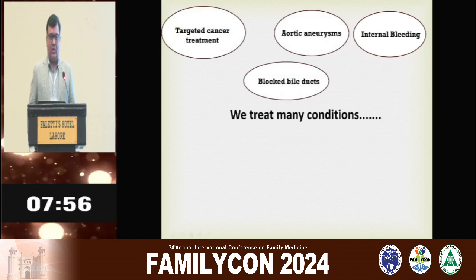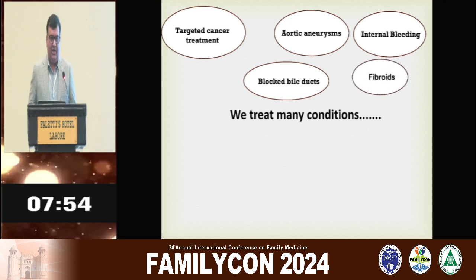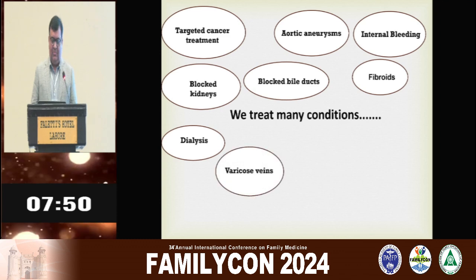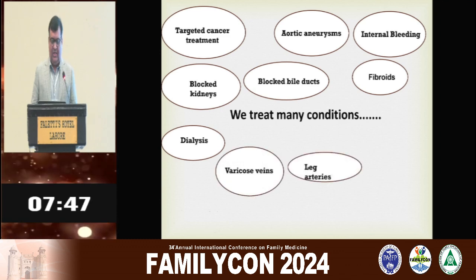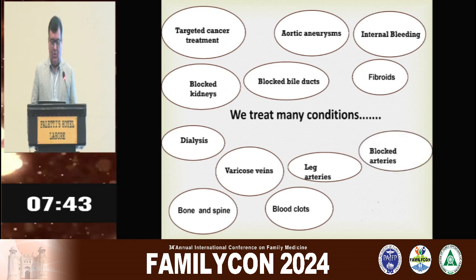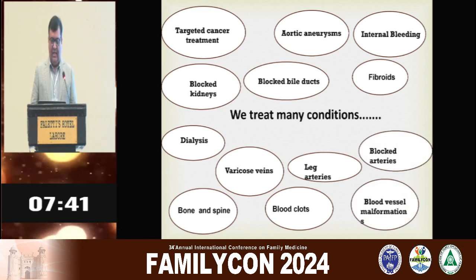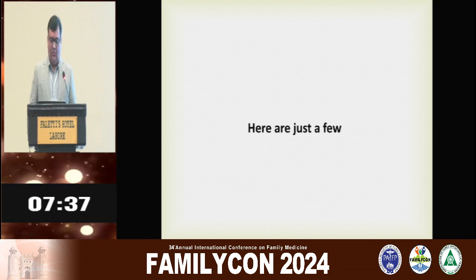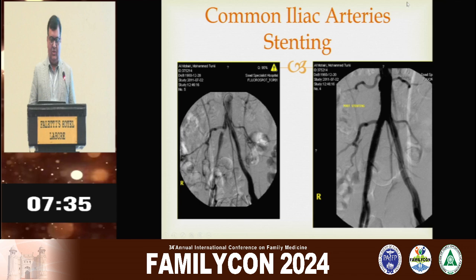We do prostate embolization, which is a very nice, neat and clean, single-day procedure, no bleeding. We do fibroid embolization. We do varicose veins, dialysis access. We do bone tumor ablations, and we also treat vascular malformations. I will show you a few examples of the procedures which we actually did.